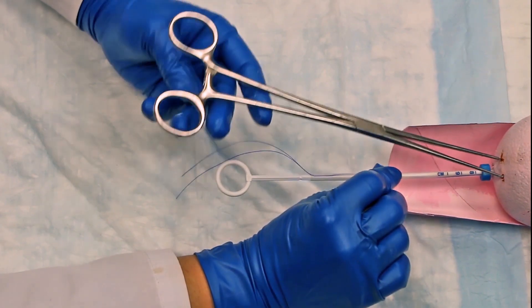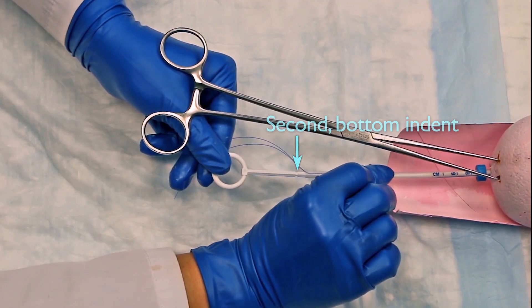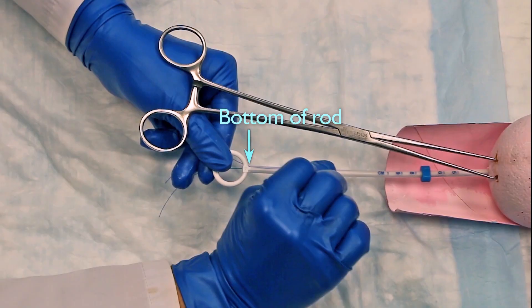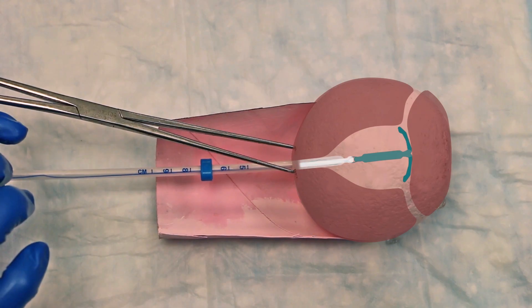Next, again gently release your hold on the tenaculum and grab the ring of the rod to hold it steady. To release the IUD from the insertion tube, gently pull the insertion tube back to the ring of the rod. You should feel a pop when the IUD comes out of the insertion tube.